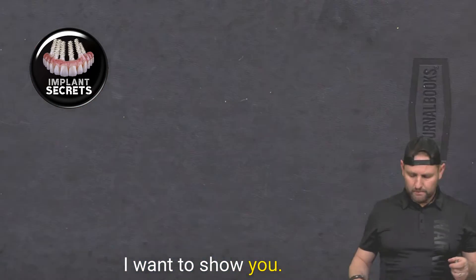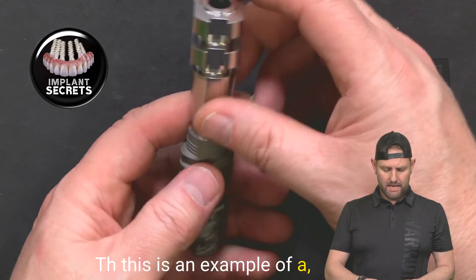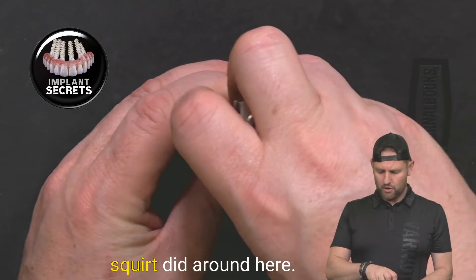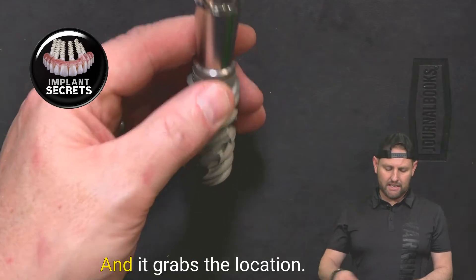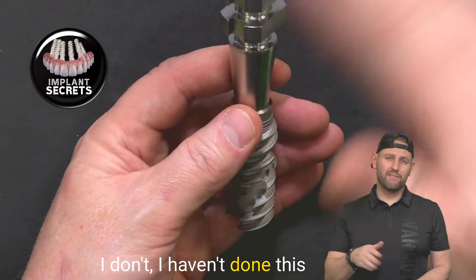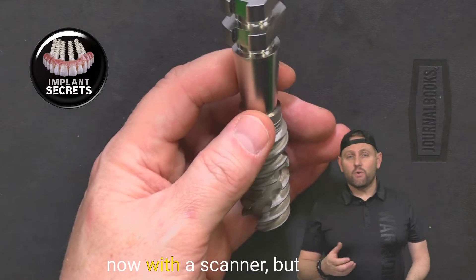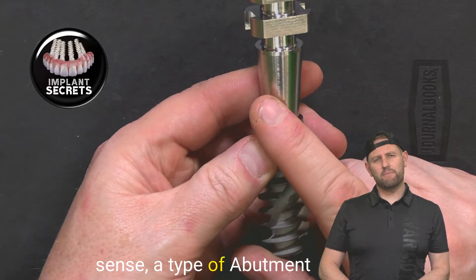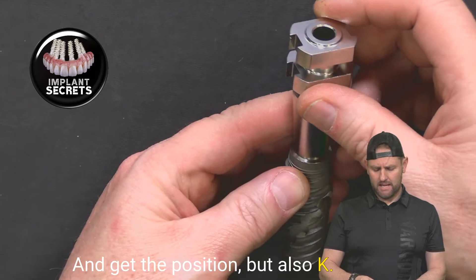This is an example of an abutment used to take an impression. Impression material is squirted around here and it grabs the location — this is analog style. Old school for me; I haven't done this for five or six years. I do everything digitally now with a scanner. But this could still be, in a sense, a type of abutment that you could scan to get the position of it as well.